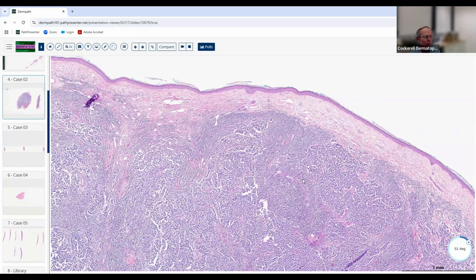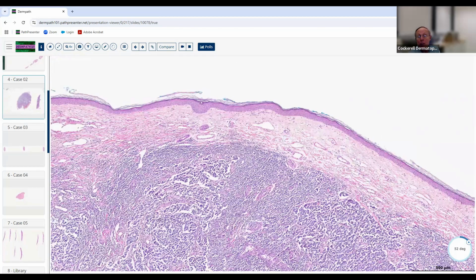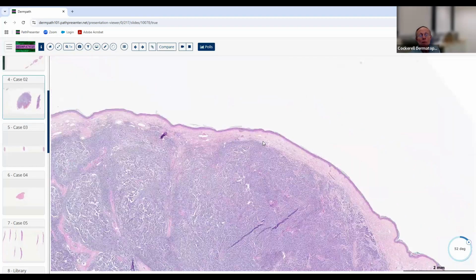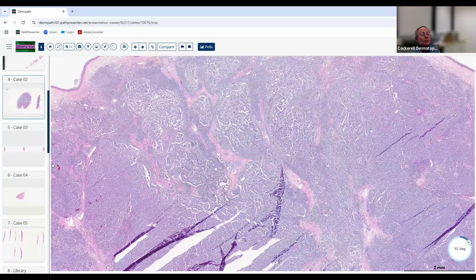Usually that pattern is seen in the types of Merkel cells that are associated more with sun damage. However, that's not a hard and fast rule, but that's a general rule. But just realize that you can sometimes see that. And you can see squamous cell carcinoma in situ overlying Merkel cell carcinoma. Don't see it in this case. So this might even be a metastatic lesion, like I mentioned before. But those are just a couple of the pearls to remember when you're dealing with this entity.